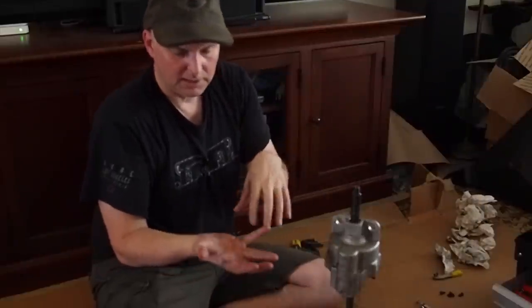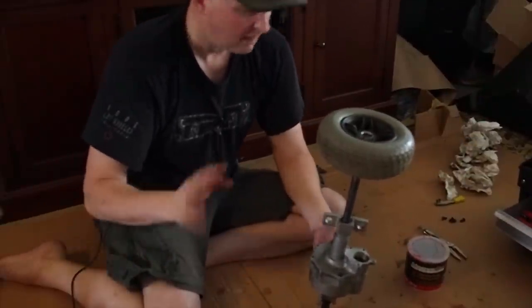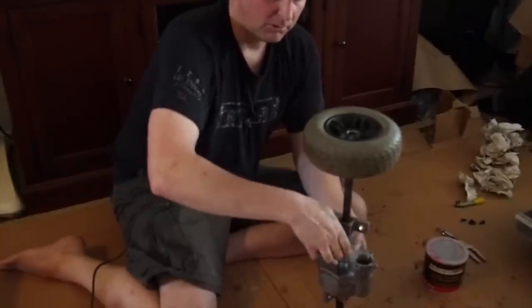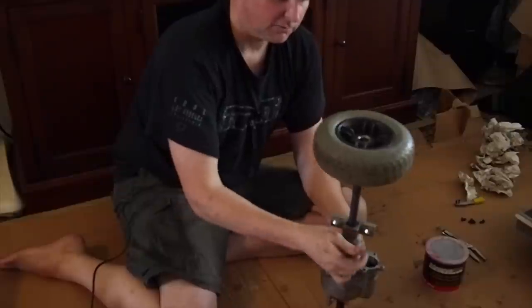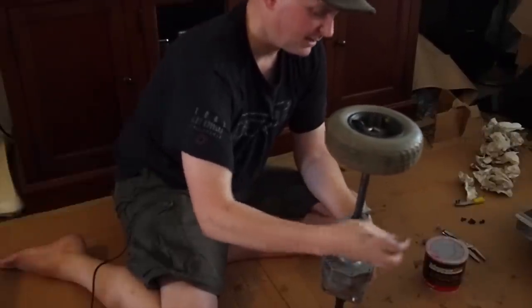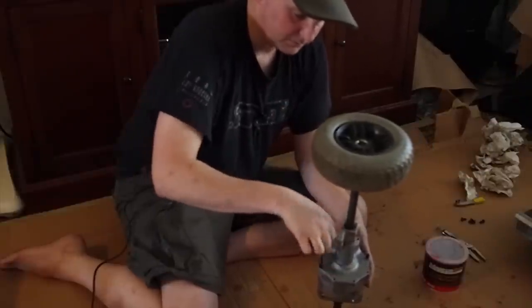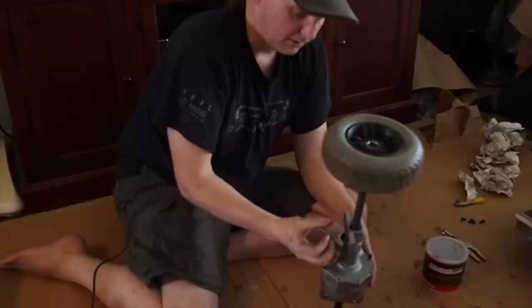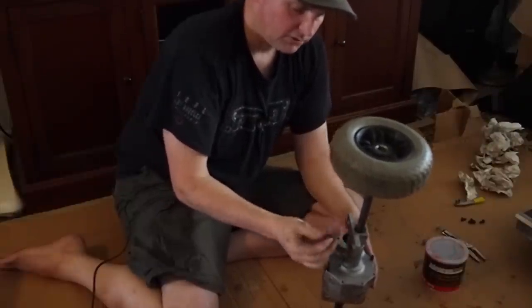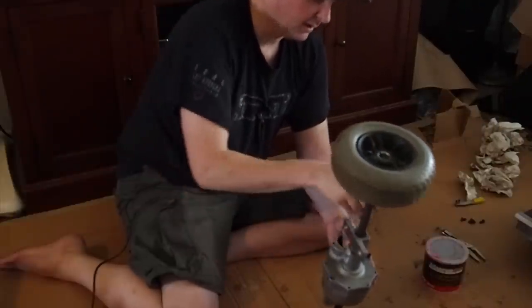So what I did was I took the big gear. I'll take it apart right now, in fact, because I'll start packing it with grease. I took the big gear, I flipped it upside down. That made it worse. When I put it back together, it made it worse. It was not happy just being flipped upside down. So I thought, well, what I'm really fighting is not that I've put it together too tightly, but that the big gear is sitting in the wrong spot on that one worm drive gear. And I think that's really what the issue is. So I kept it flipped over, and then I moved the big washer so that it would push it further up that worm drive gear, and that's where we are now.